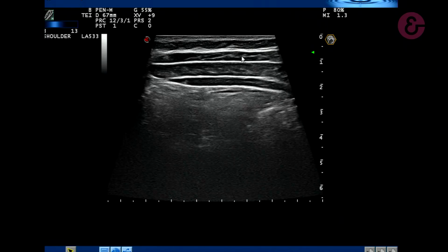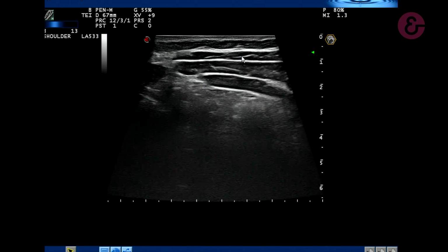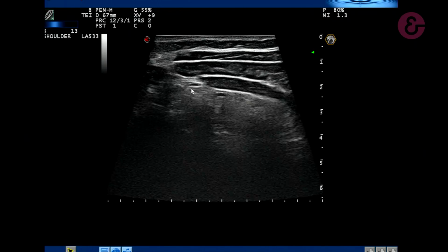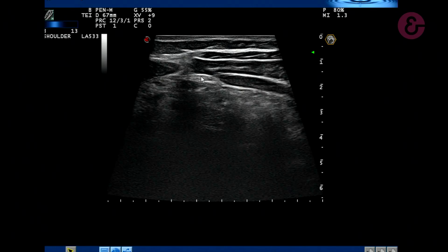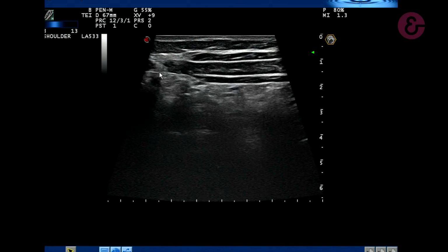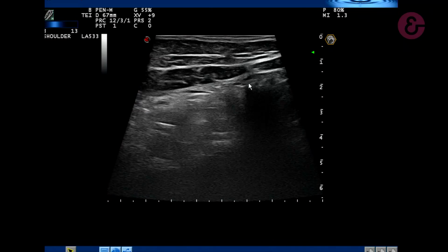Breathe out. Very good. So keep this contraction. So now we can see the muscle is contracted and the fascia here is in tension, and relax. And now the fascia is relaxed. So this fascia will arrive to the linea alba in this direction.